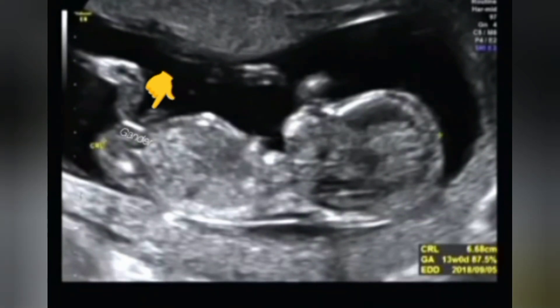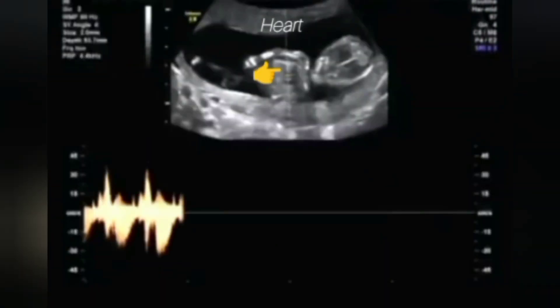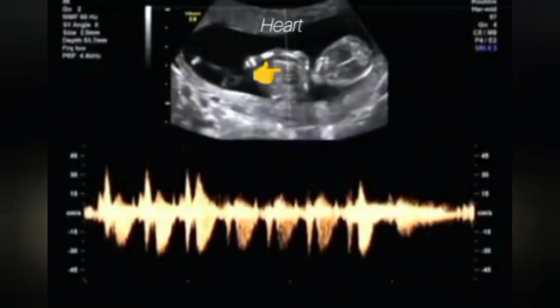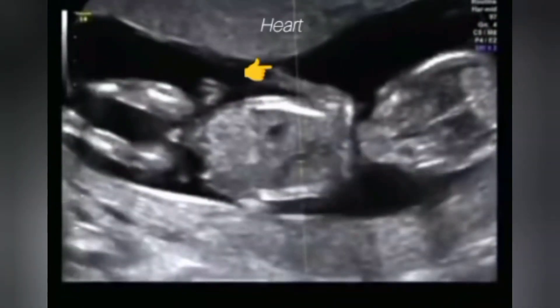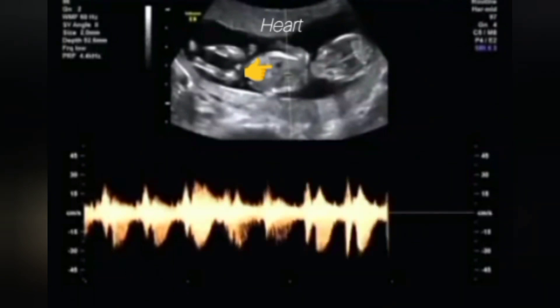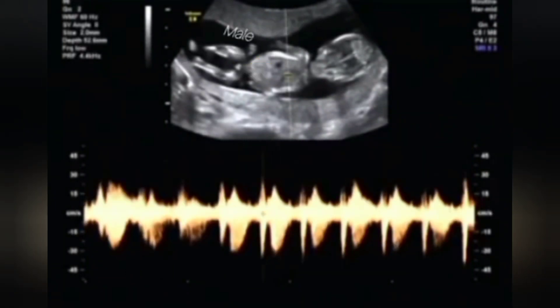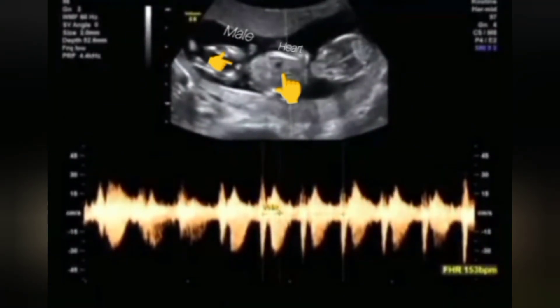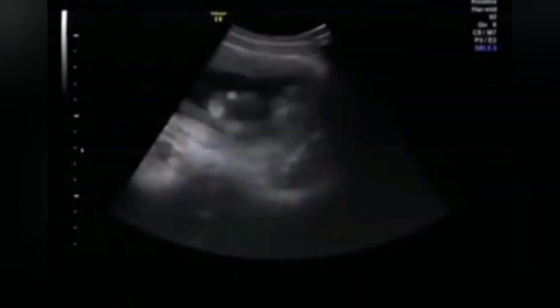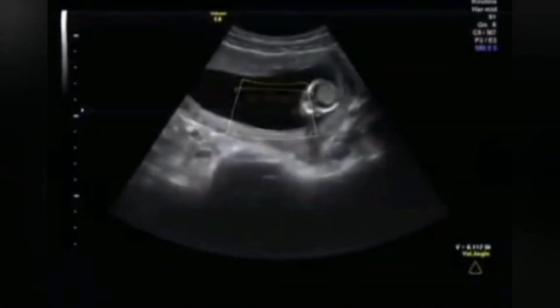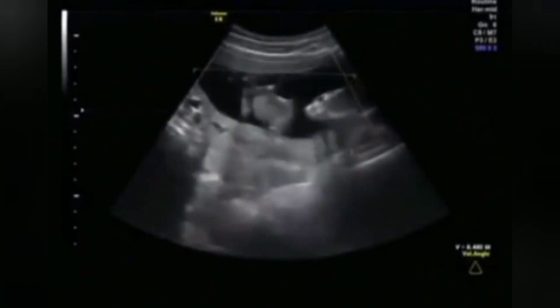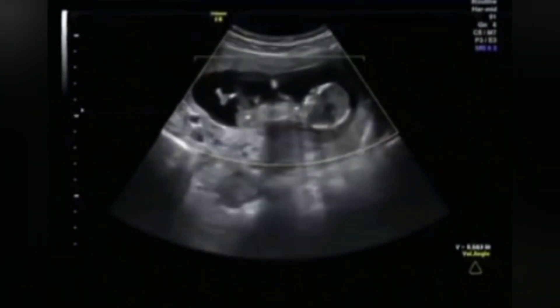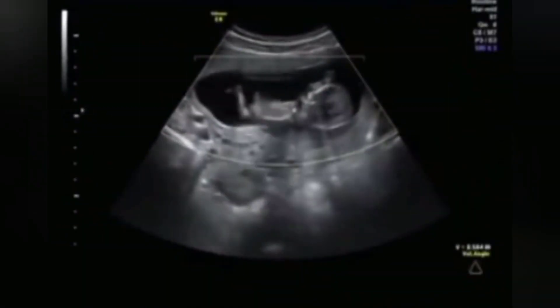You can see this is a male child. Now we will take the heartbeat of the baby — it's about 158 per minute. This gestational sac has an age of about 13 to 14 weeks. This is clearly a male child baby. Now we will change the mode of scan.